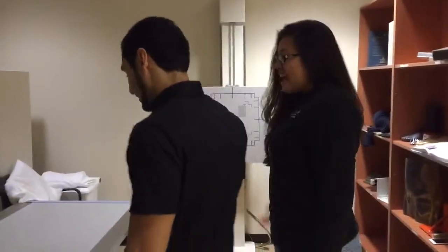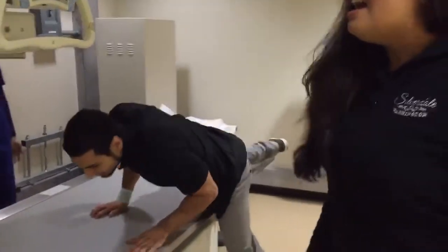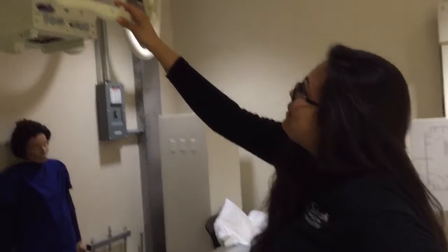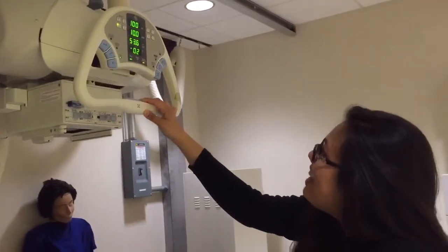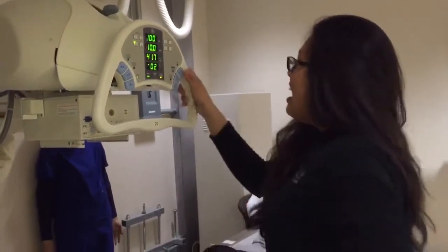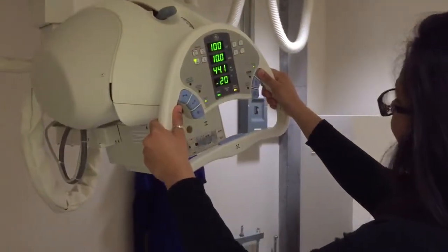I'm gonna have you lay face down on the table. You got it. And this projection is called PA axial. So the first thing we're gonna do is put the SID to 40, at least 40. I set it to 42, 41. And then angle it 15 degrees.